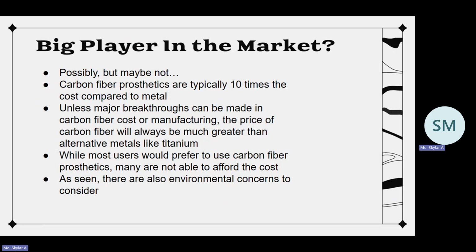While most users would prefer to use a carbon fiber prosthetic, many are not able to afford the cost, and typically this cost won't be covered by insurance. As seen, there are also the environmental concerns to consider. However, with a big breakthrough in the market, carbon fiber prosthetics could become much bigger and end up dominating the market.